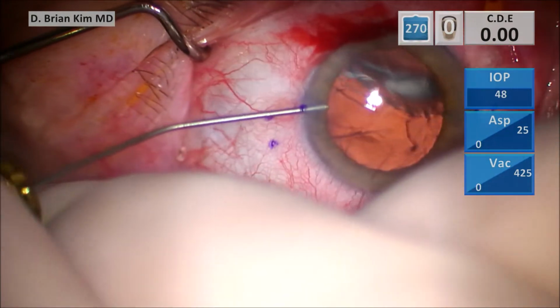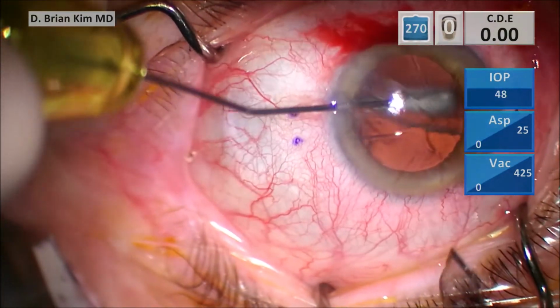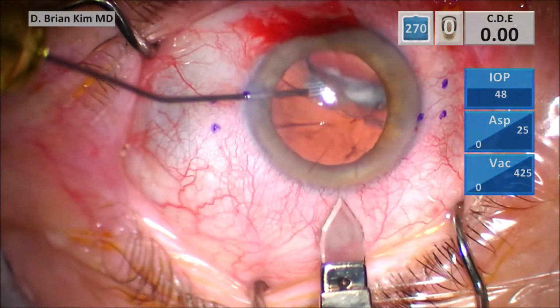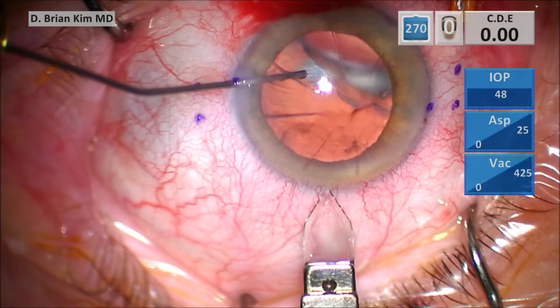Also want to firm up the eye a little bit as I make my incision. So I use that same cannula to hold the eye. You can see the lens dangling and kind of swinging back and forth. And again, this patient's had RK, so I have to be really mindful. I really don't have a lot of options in the positioning of my main incision. I have to put it right there.